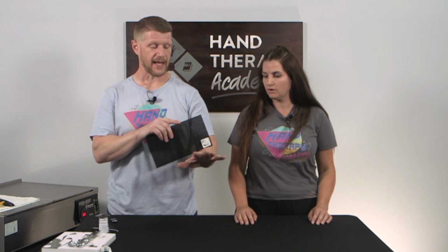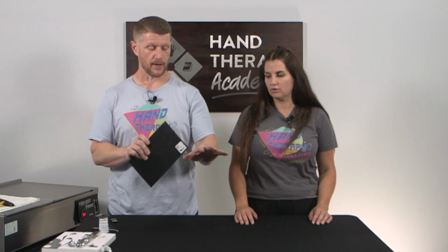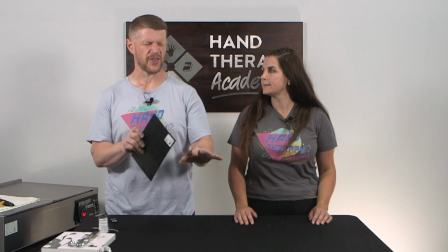Okay, we're going to show you how to make a low profile radial palsy orthosis. So this is for that person who has a radial nerve lesion and they have drop of EDC, of wrist extensors, of thumb, sometimes but not always, and sometimes you'll make this where you don't have to include the thumb, but we're going to show you with the thumb because that's more common.